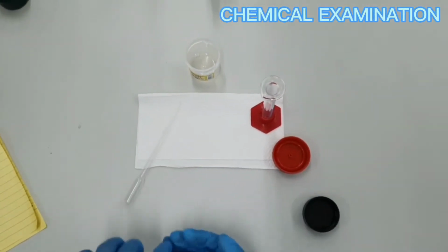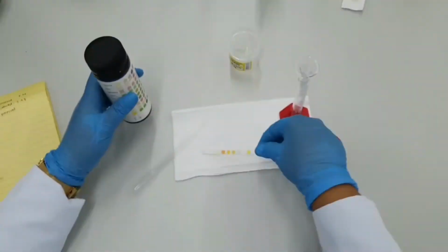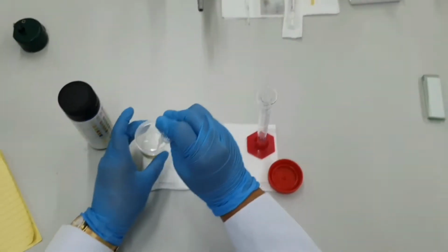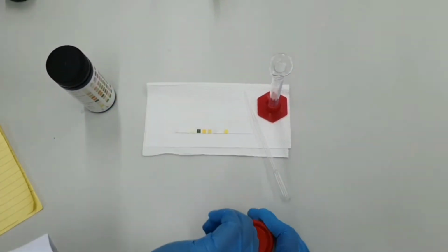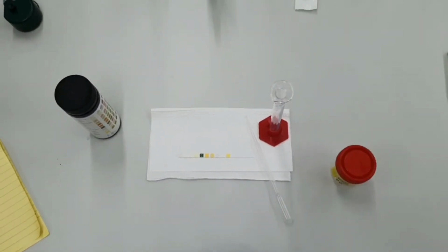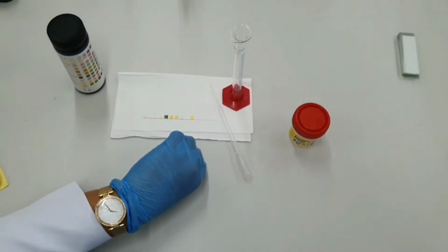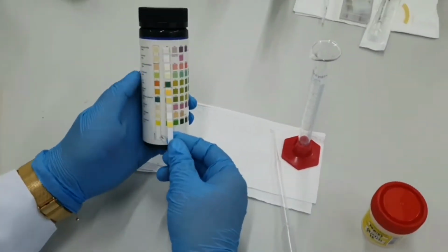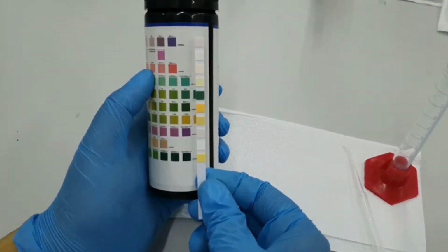For the chemical examination, use a reagent strip to determine the pH of the semen. Place 1 drop onto the pH pad of the strip and read after 60 seconds. After 60 seconds, it revealed that the sample has a pH of 8.